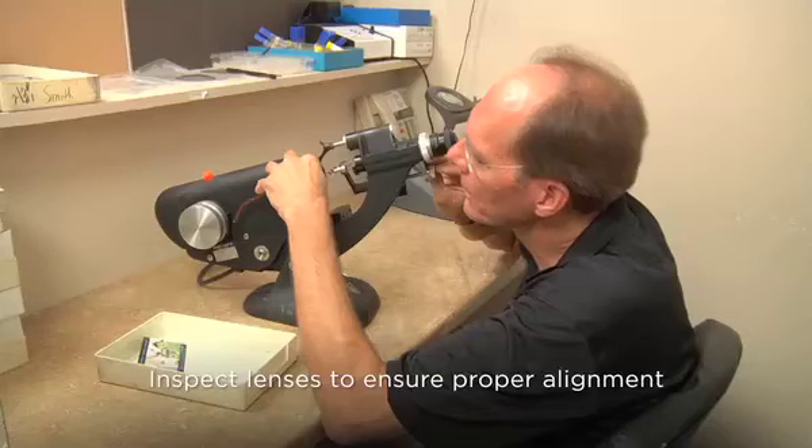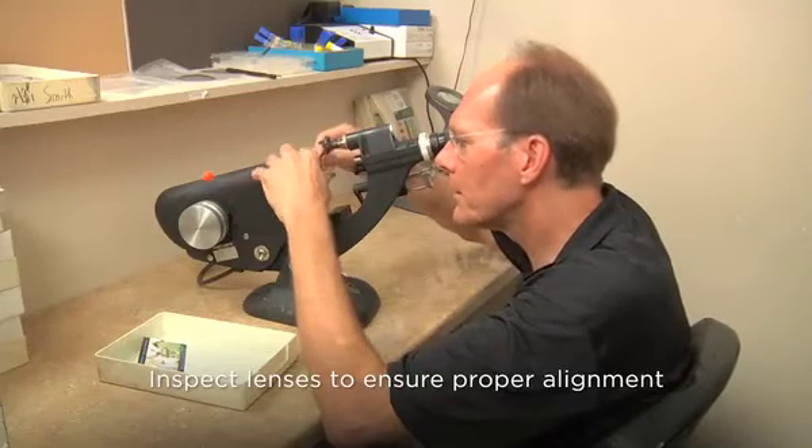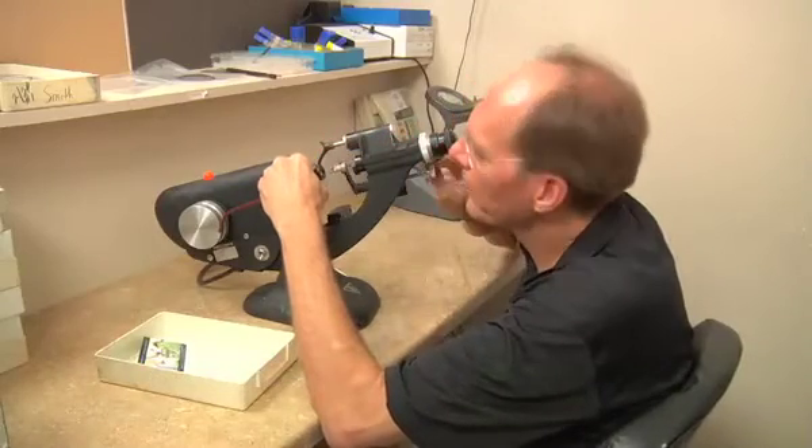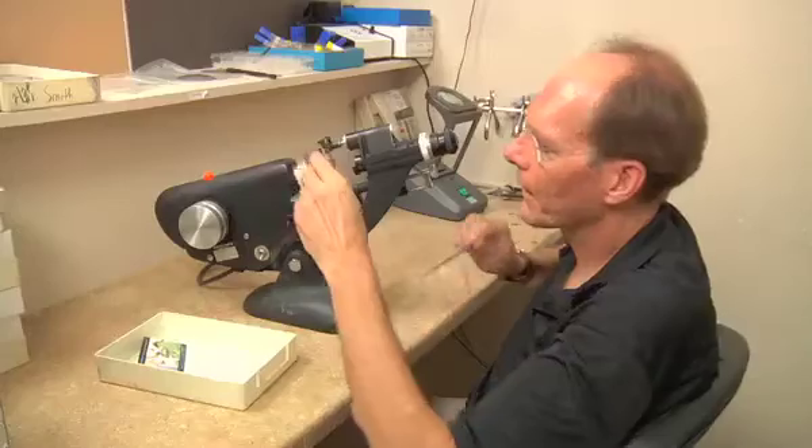After mounting, be sure to inspect Transitions Vantage lenses to ensure proper alignment. Occasionally, due to decentration, the markings on one side of the lens may be cut off.